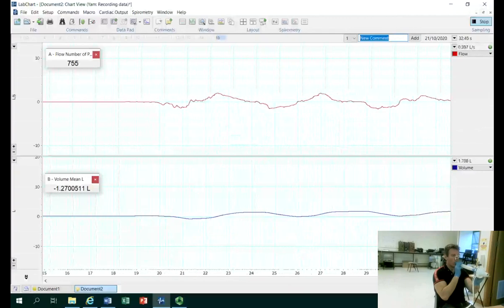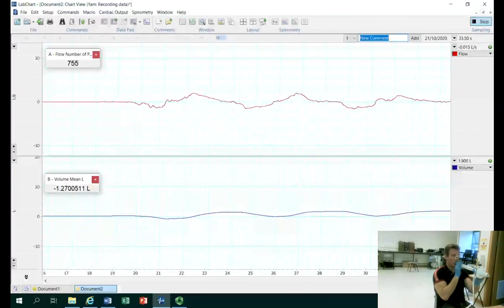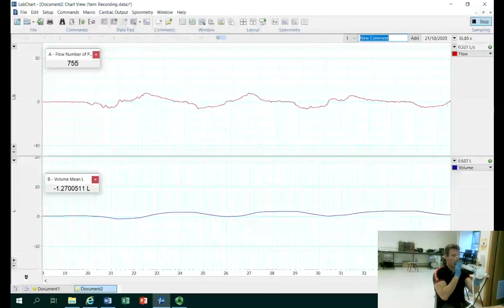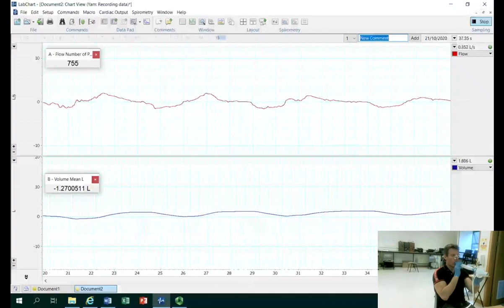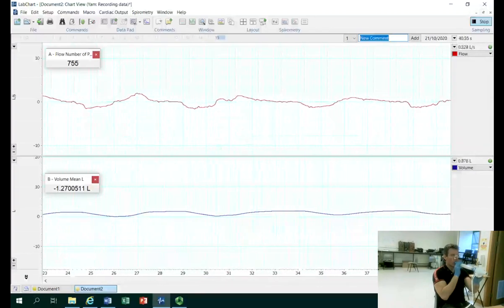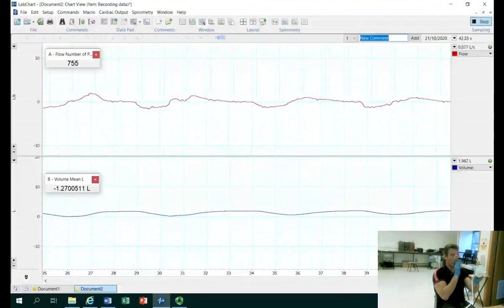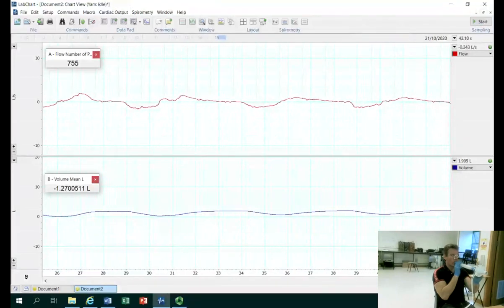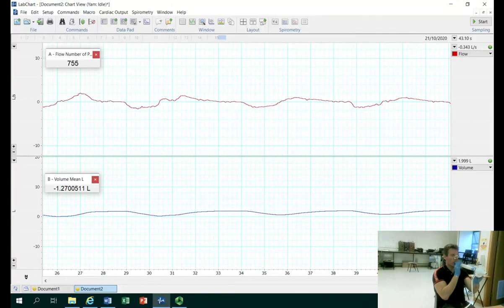At this point we'll ask the participant to breathe normally, try to attain a normal breathing rhythm and try not to be overly conscious of their breathing. I'm going to pause recording for a moment just while they're normalizing their breathing rhythm, then start again and record about a minute's worth of breathing normally. We're looking for a normal tidal volume here.